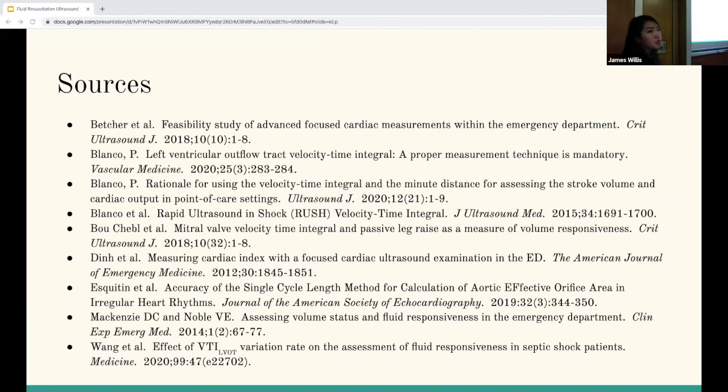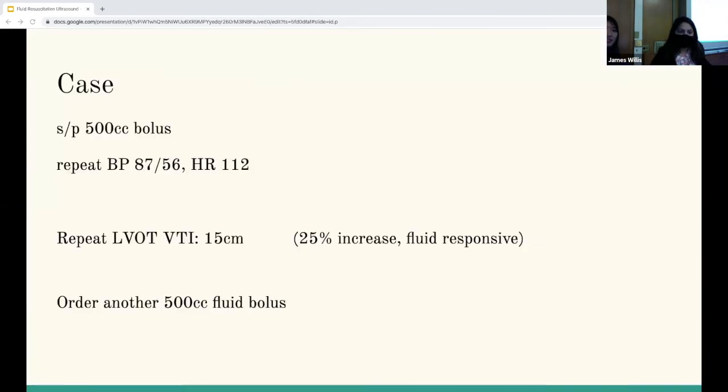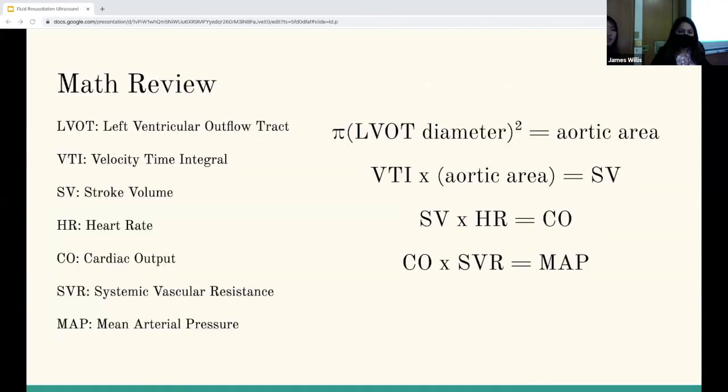Can you go back to the equation? Like, to that equation. You could say what would be... No, I mean, the heart rate changes diastolic filling time. So the stroke volume. Yeah, the VTI is just looking at individual beats. So that's why it doesn't have to matter. It measures stroke volume. Once you do the rest of the calculation, you get stroke volume from it. But this whole delta is just looking at, if you go back, it's directly correlated with stroke volume.